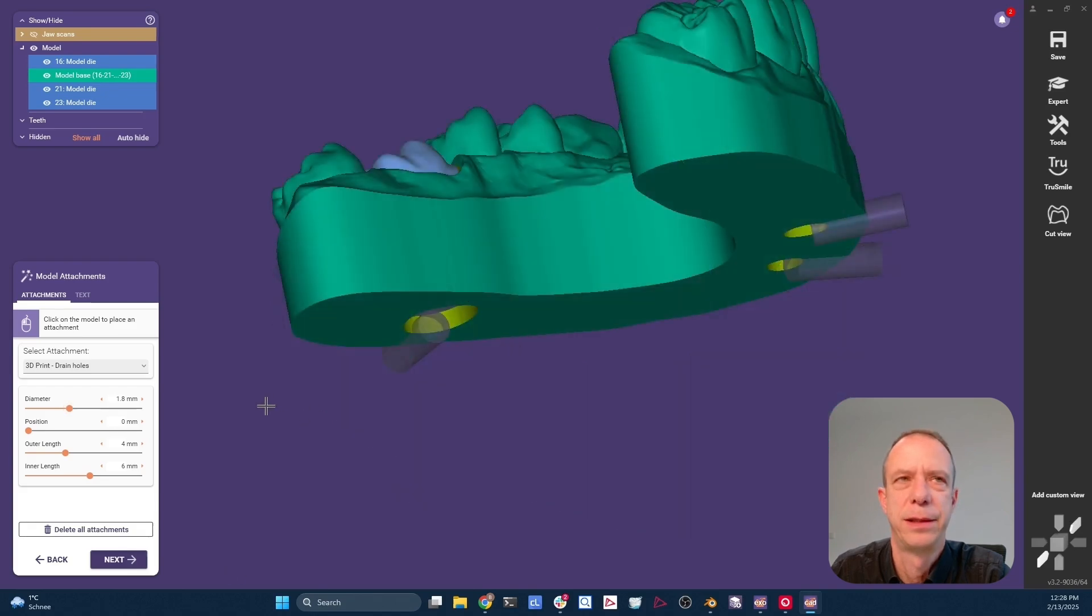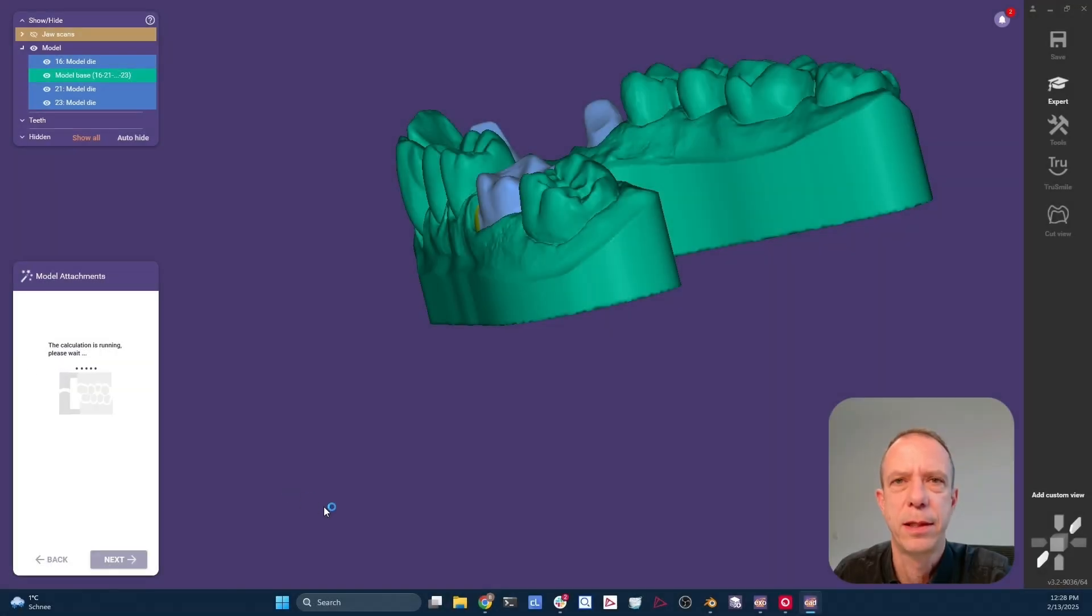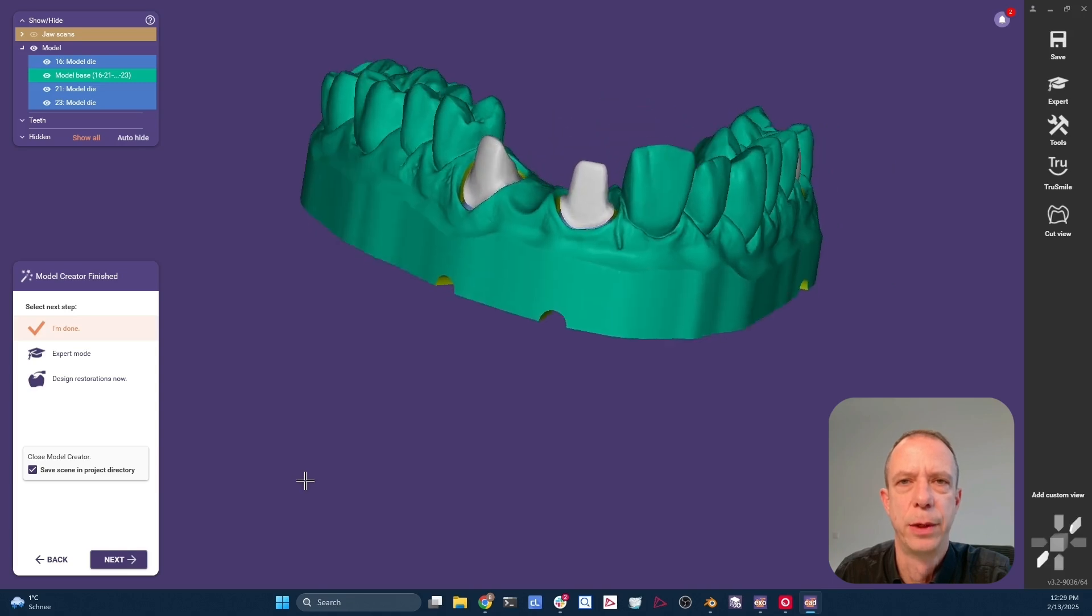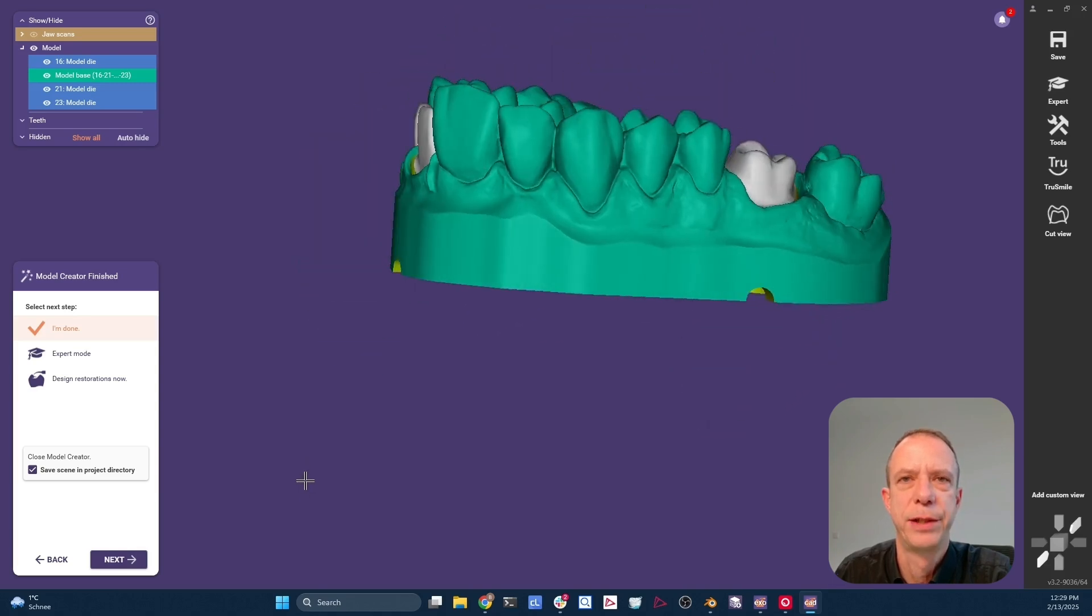And yes, we could also add a text here. When we click next, all these little things get applied. And we're good to go. That's our little model ready to print.